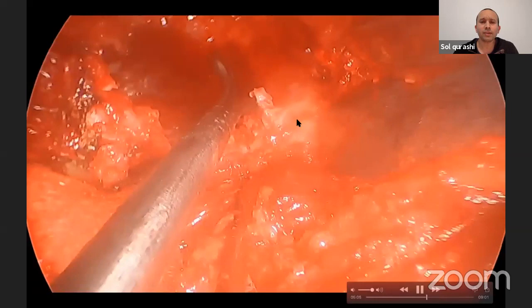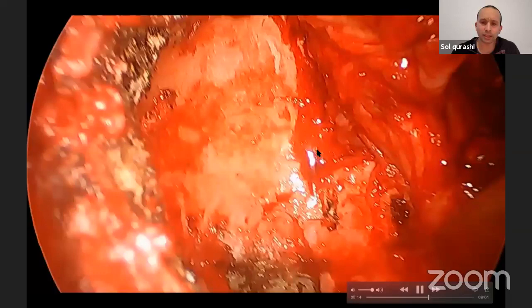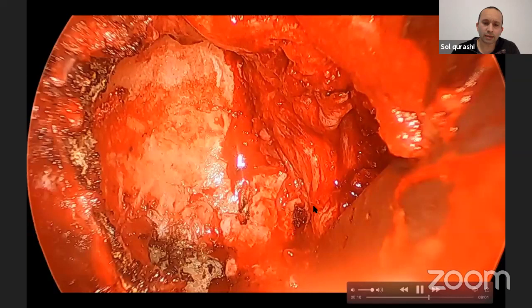And the TAL is, sorry. There's the floor of my acetabulum there that I've diathermied. There's the TAL. And that's the sort of view you get. Once you've done that, this is a targeting device. You can use that, or you don't have to use it.